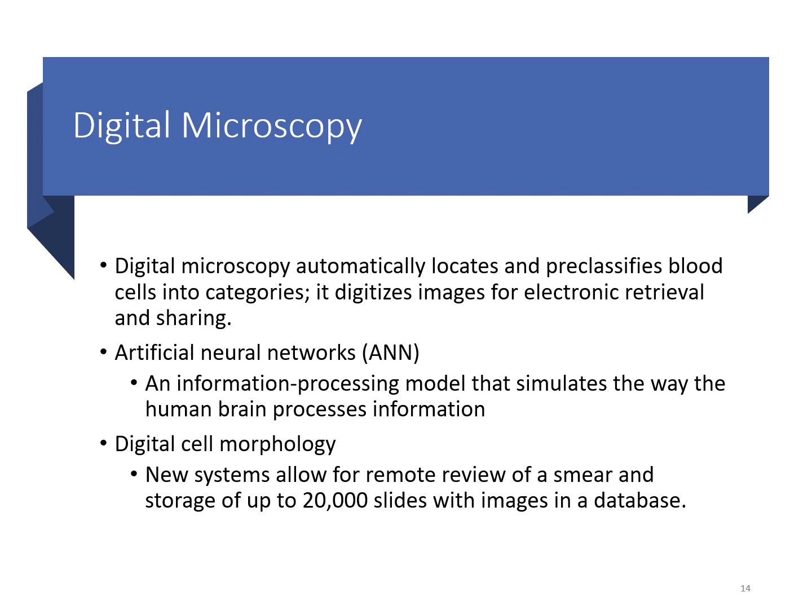We're starting to see a lot more digital microscopy in the medical laboratory field. You'll have some analyzers that have this component tied to the analyzer. The analyzer will make a slide, look at the cells, and pre-classify what category to put those cells in. A urinalysis analyzer will do the same thing. It'll make a slide out of the urine and run it through a digital microscopy unit, where it will start classifying crystals and cells and various things in it.